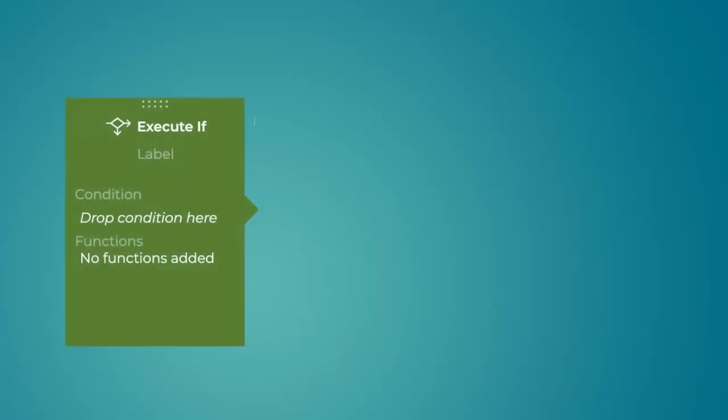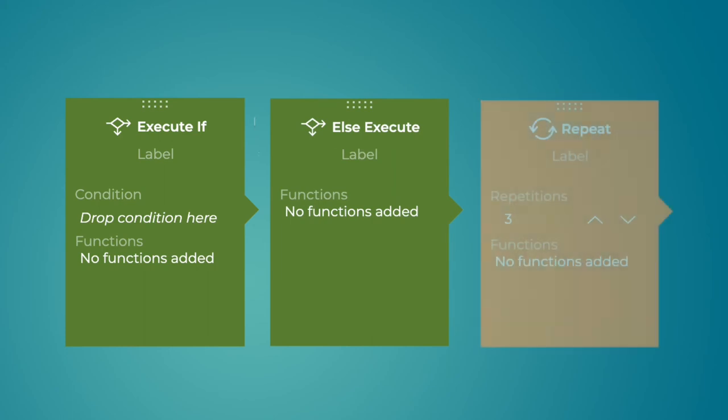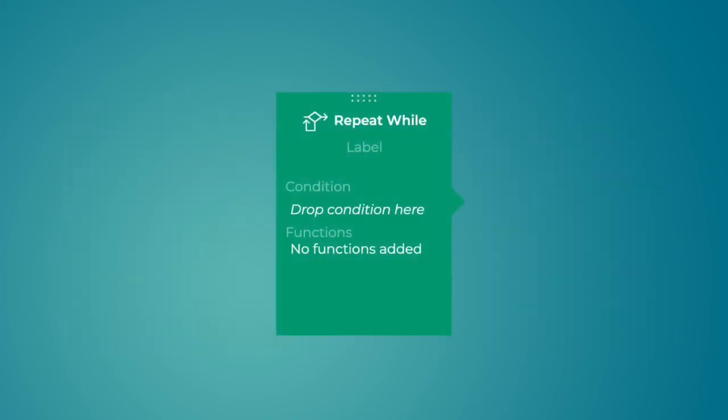We have now understood how Execute If, Else Execute and Repeat blocks work. Let us now take a look at Repeat While. This block allows you to create a container whose steps will be repeated as long as the defined condition is true.